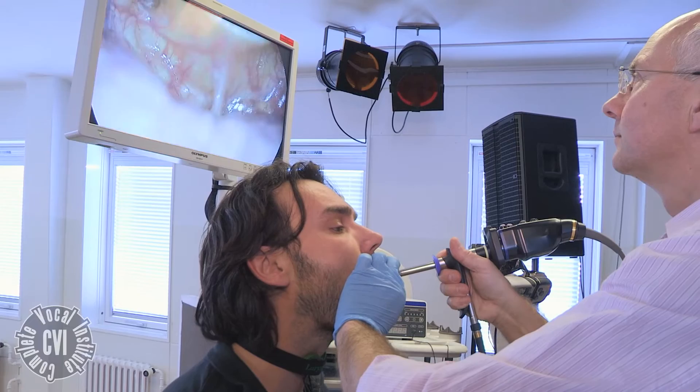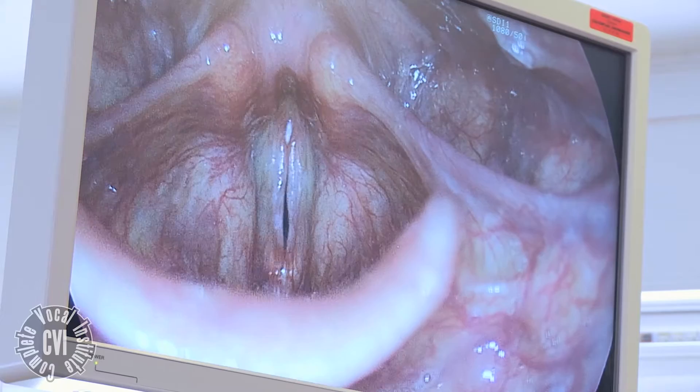The advantage of the rigid telescope is that it gives extremely high quality images, so we can look at the very fine detail of the vocal folds and how they're vibrating.